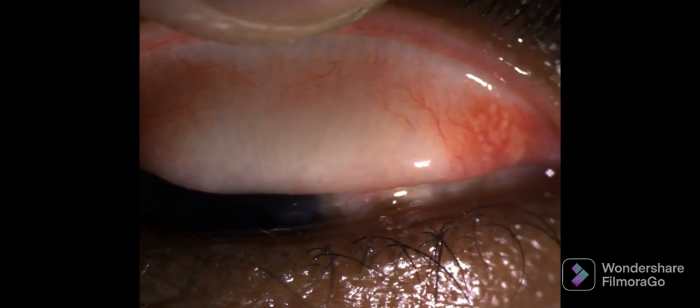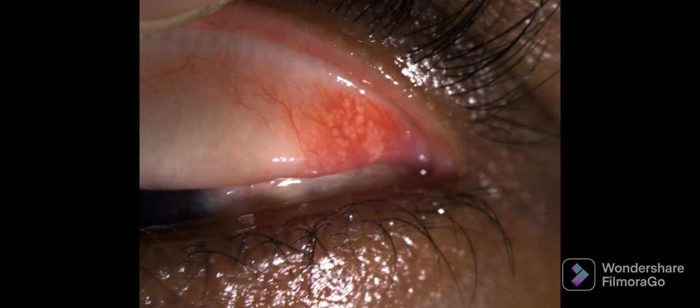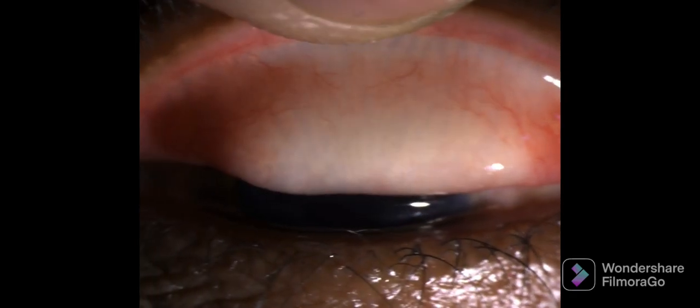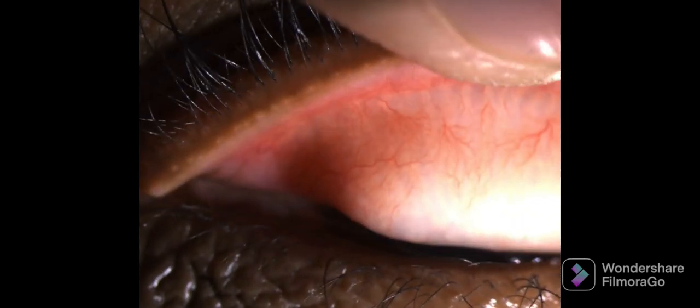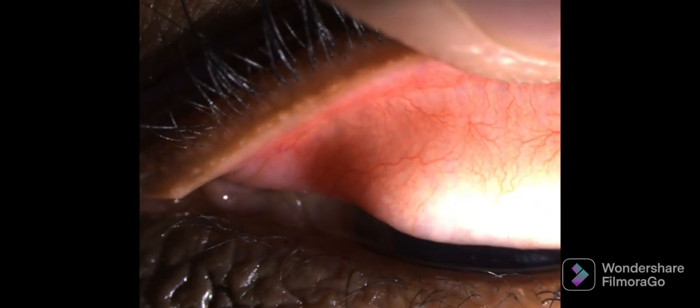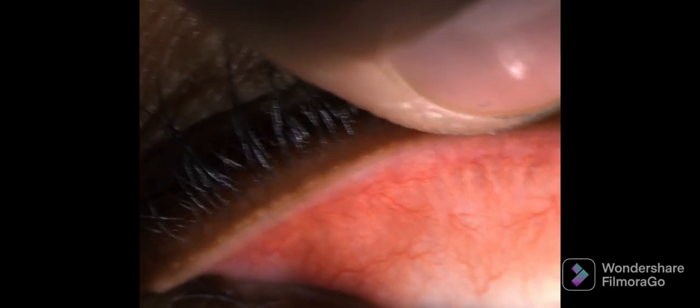The tarsal conjunctiva is examined for the presence of any papillae, follicles, or concretions. As you can see, this is the clear tarsal conjunctiva, and the small circular structures show the Meibomian gland openings on the upper eyelid. This is the normal pattern.